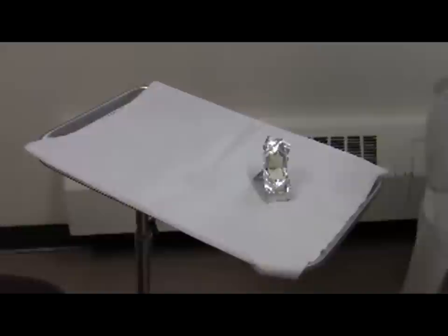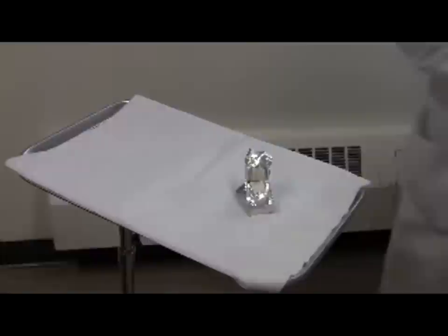You can use matches to burn the underside of the slide, and there's going to be some KOH material, but when we go to the lab we'll see those materials.